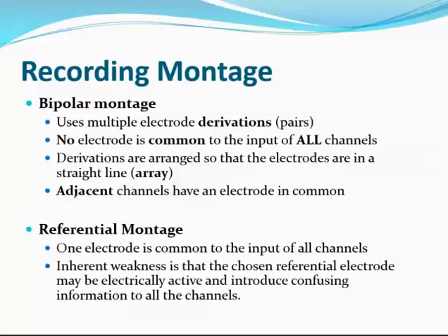Let's say, for example, you have input 1, input 2, input 3, and you might have one reference to 1 to 2, and then 2 to 3. You see 2 is common to these channels.